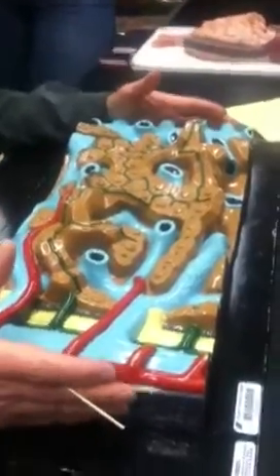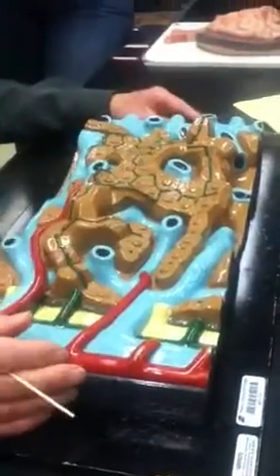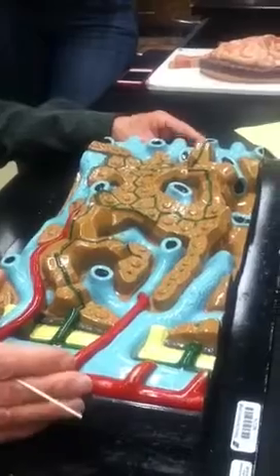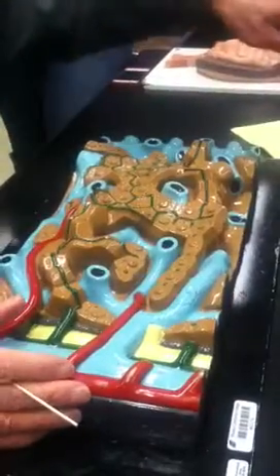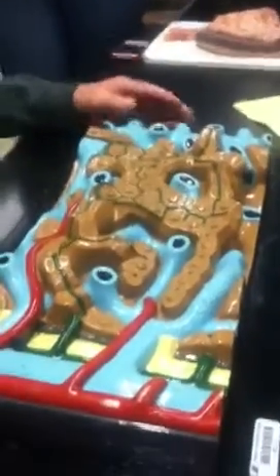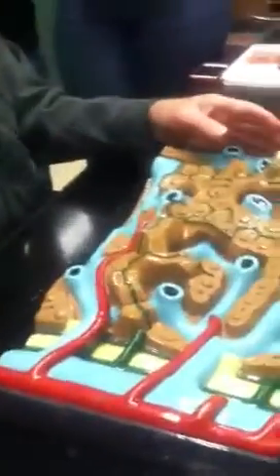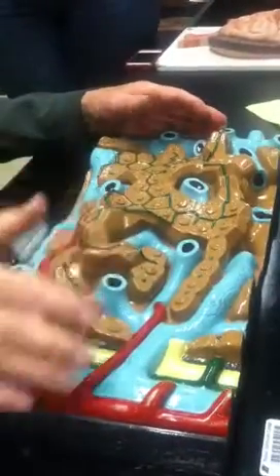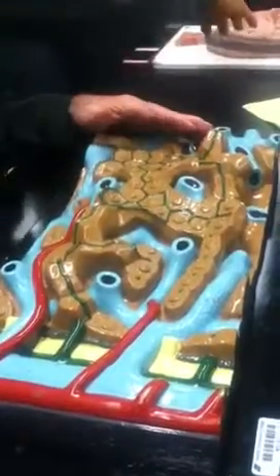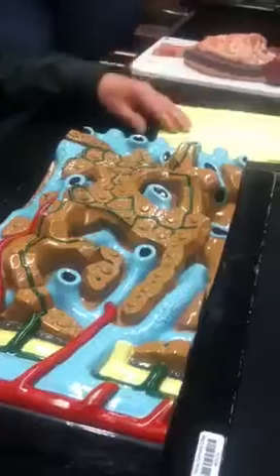This is a piece of liver. Histology means microscopic sectioning of the cells making up the organ. So in that case, we have the small intestine. In this case, we have a piece of the liver. What you have to picture is that this is the middle, and this is a circle all the way around, so that a mirror image of this would be on this side, okay? So this is sort of the center. In fact, this is known as the central vein, the central vein. Right? So we'll get to that in a moment.